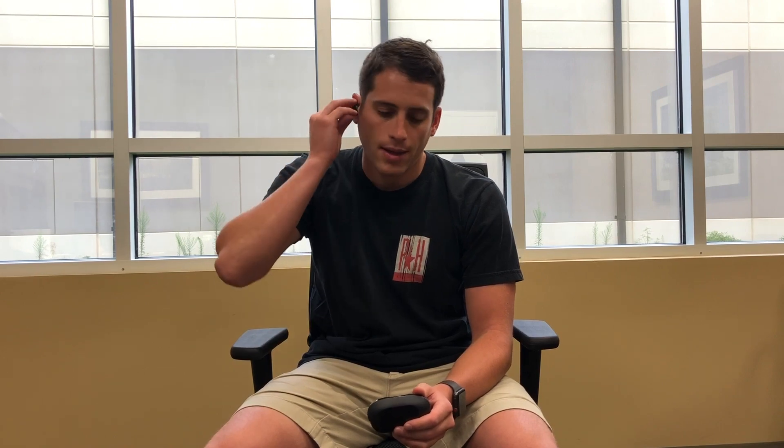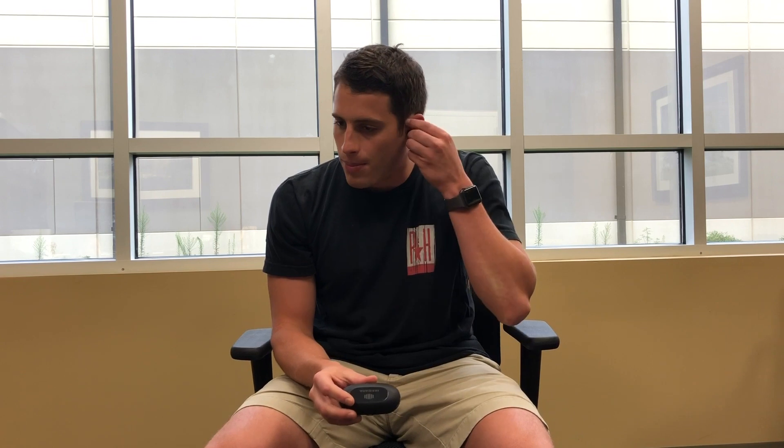The Boost, from a hardware standpoint, is pretty similar to the original IQbuds. The difference being that these are all jet black. From a battery life standpoint, they have the same 20-hour battery life as the originals — that's 20 hours of continuous Bluetooth usage. You can also pop your IQbuds into this charging case at any time, which has about three charges in it, so you should never have an issue with battery life.